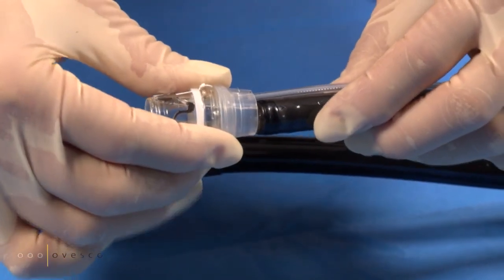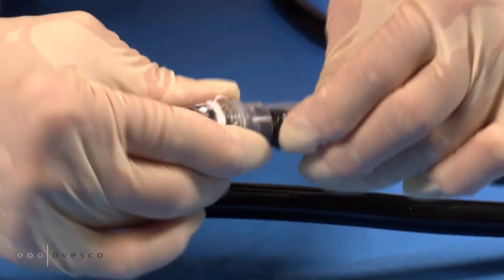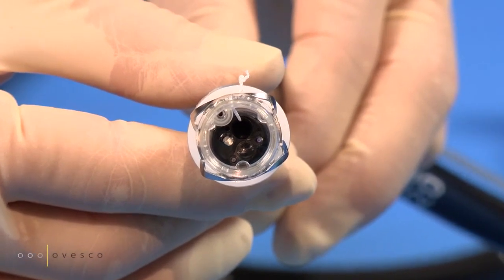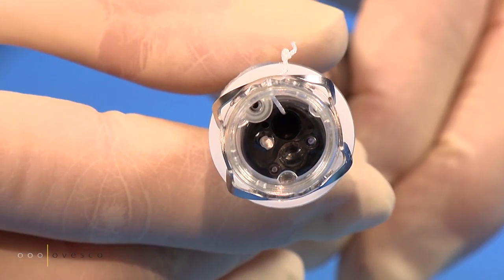Push the cap onto the endoscope until it reaches the stoppers. Ensure that the thread runs straight into the working channel and is not wound up around the snare shaft.